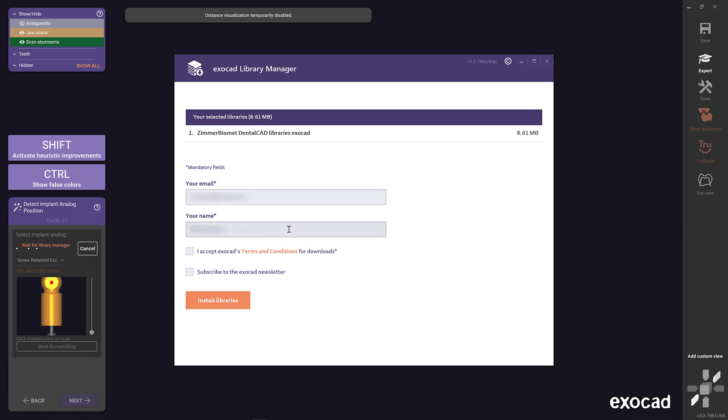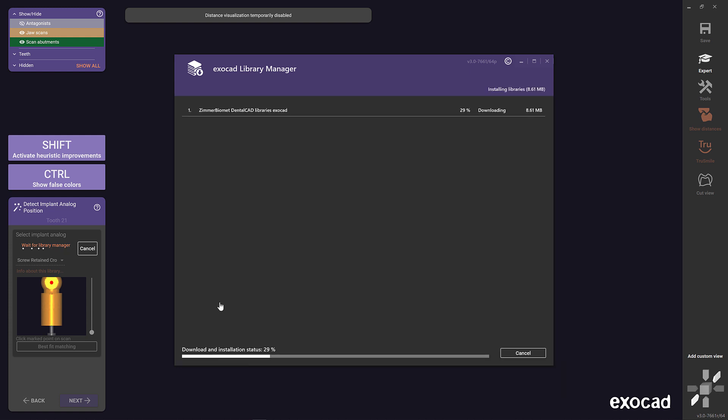After the download and installation, you need to restart the software to update the library.